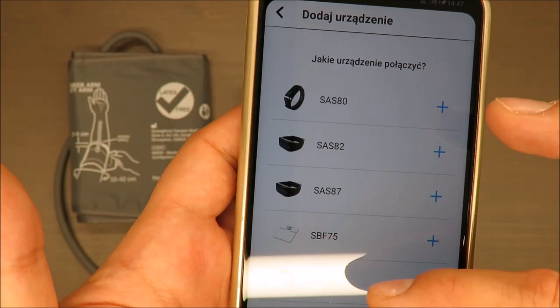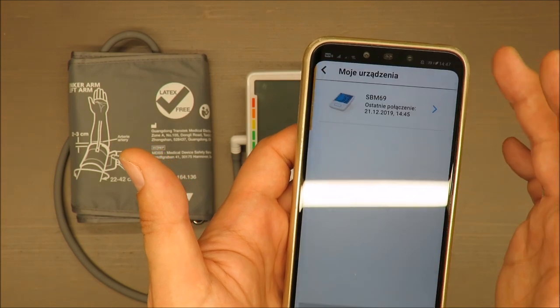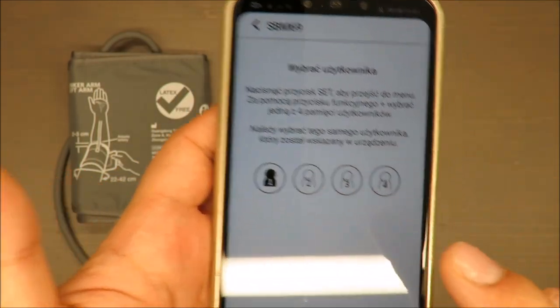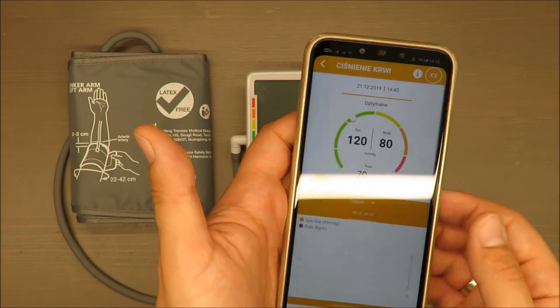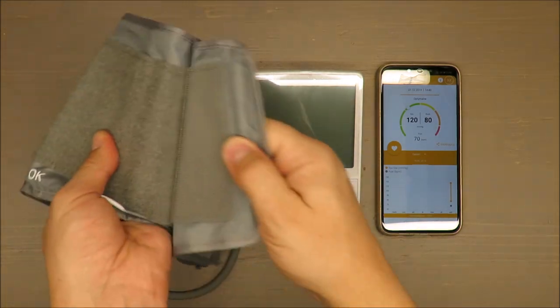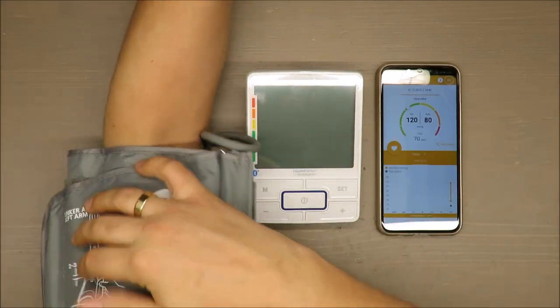This is actually the SBM 67 model. I'm already connected. Sorry, 69. I did that just recently. I can also choose one of four users. So let me check my blood pressure according to this device. I recently drank a coffee, so I'm also a little bit curious how it's going to be. Don't take it seriously, it's just for the test.